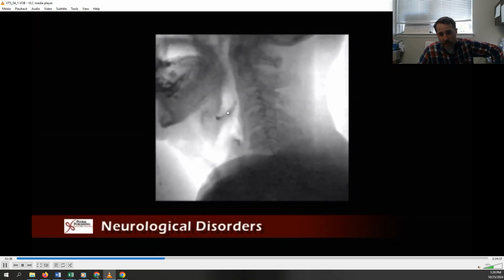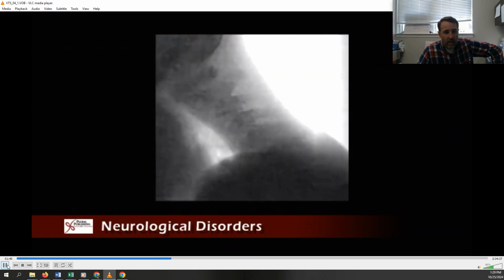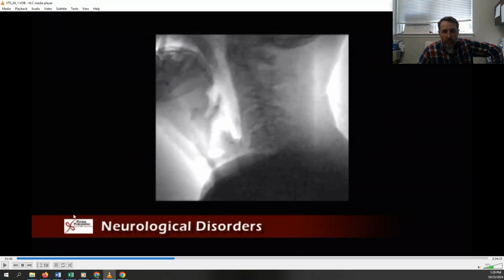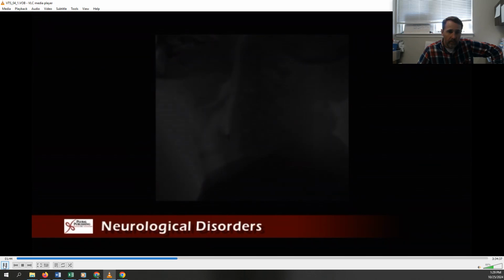Pharyngeal stasis. Upon completion of this examination, this gentleman decided he would no longer take any food or drinks orally. A little bit of pharyngeal stasis in the vallecula and the piriforms. He seems to have cleared that. As he found eating too exhausting.